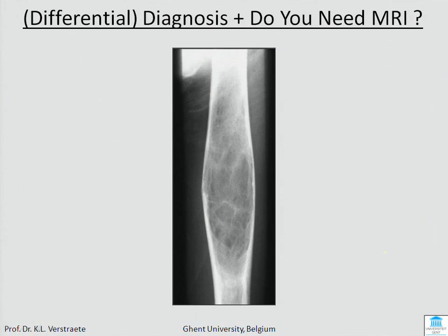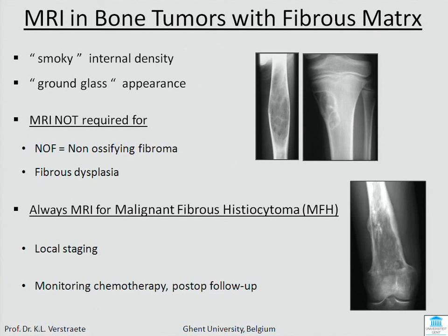Next case — any idea what this is? This is a femur, and it has a smoky appearance, or ground glass appearance. We know this in fibrous dysplasia. This one here is fibrous dysplasia and you don't need MRI. And for non-ossifying fibroma, you don't need CT, you don't need MRI — it's a don't-touch lesion.